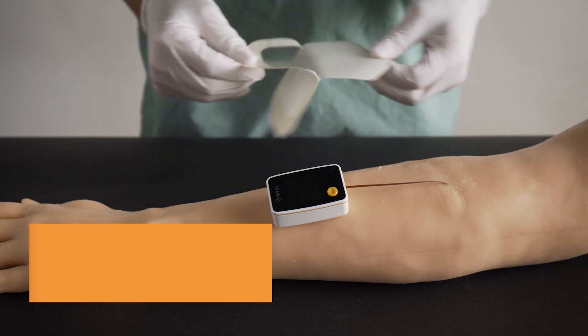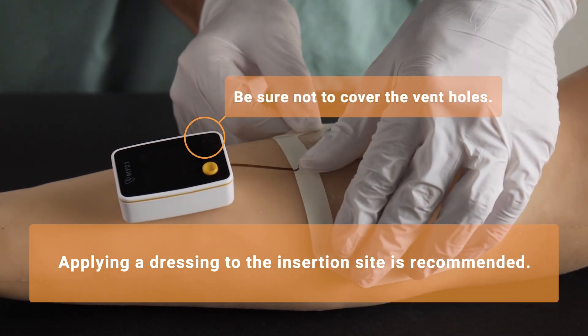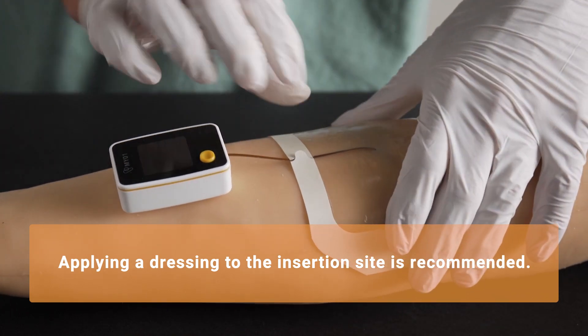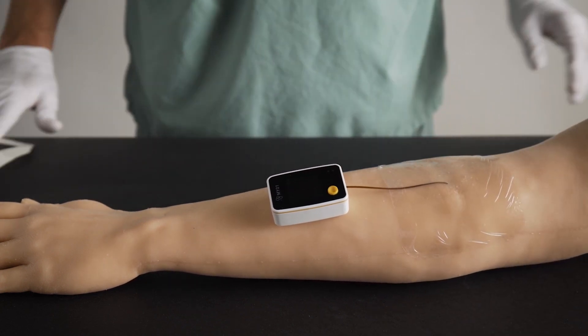We recommend placing a medical dressing — in this case a Tegaderm patch — on the insertion site to ensure that the lead wire does not move around during the monitoring period. The device is now ready for up to 18 hours of continuous intracompartmental pressure monitoring, and can be used on its own or paired with our optional Myo-1 mobile application.